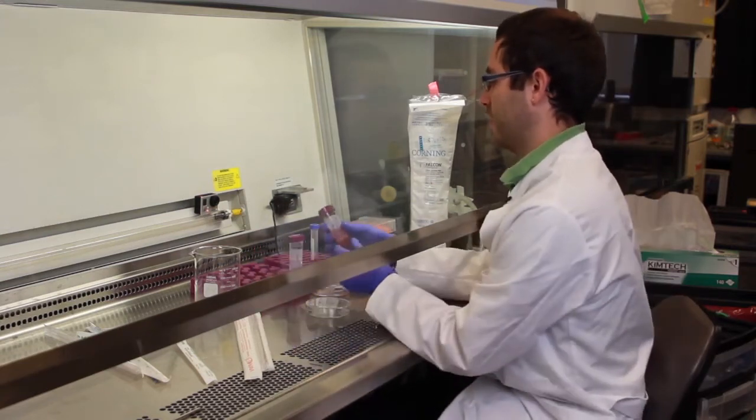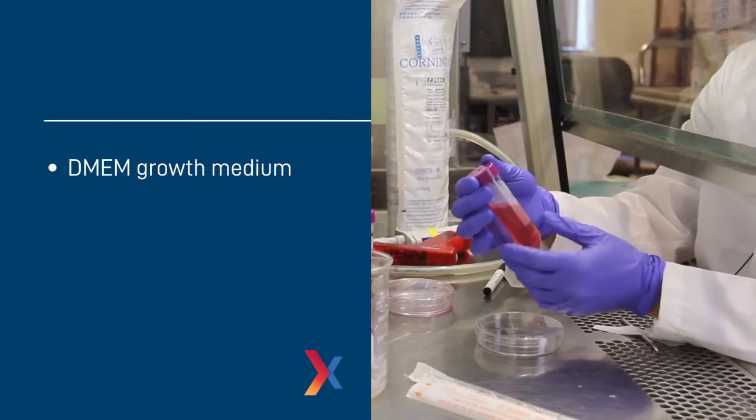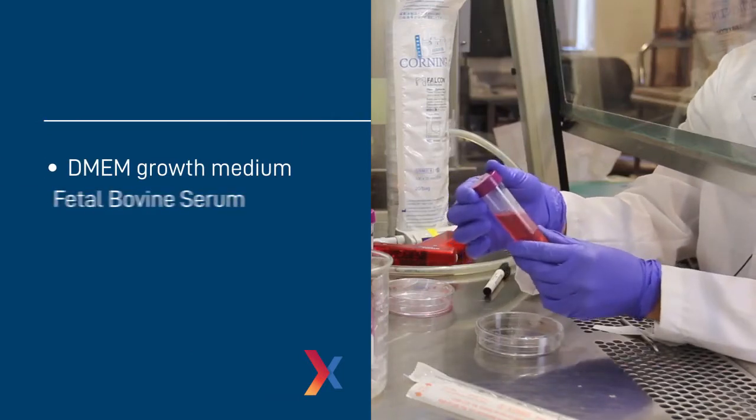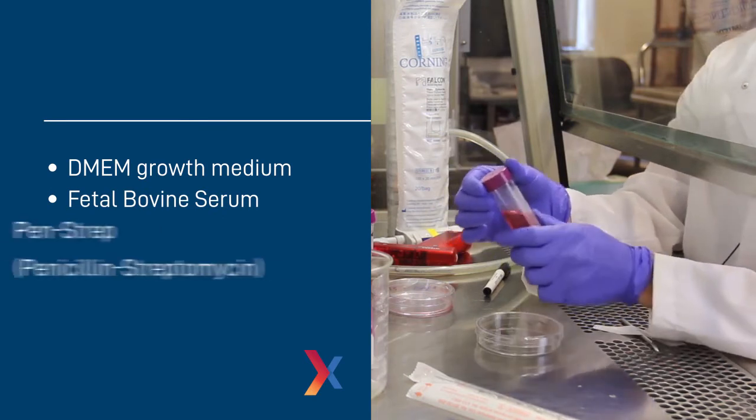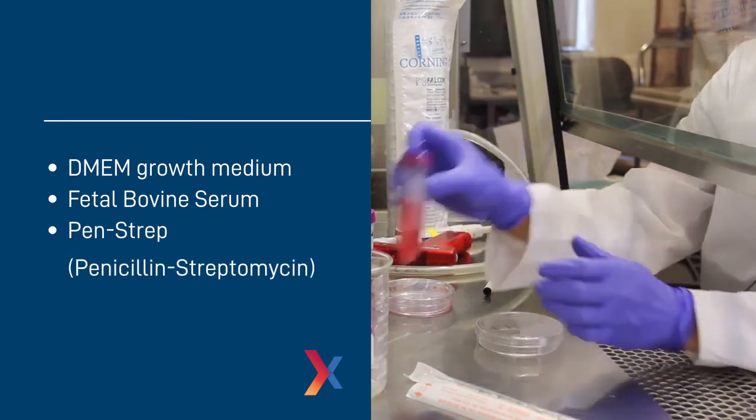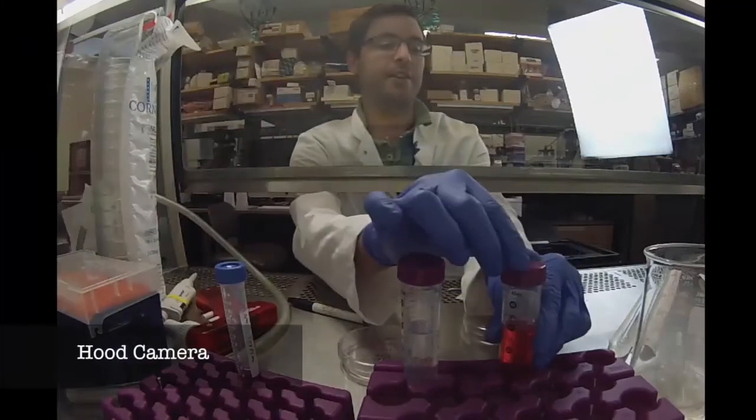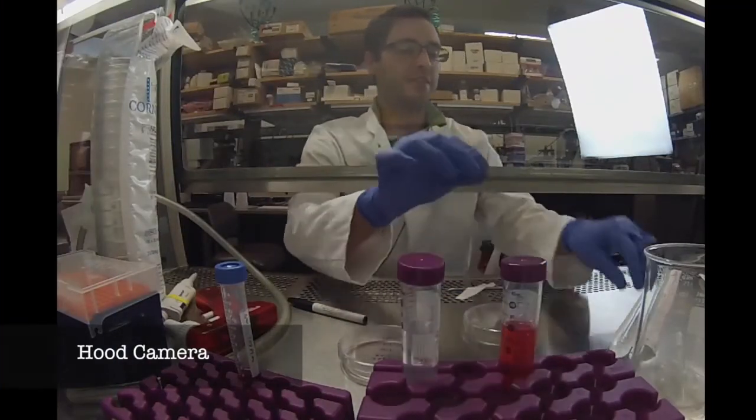So I can already take this fresh medium which is just standard DMEM growth medium. I've added to this fetal bovine serum which provides nutrients for the cells, and Penn Strep which acts as an antibiotic to help prevent against contamination.